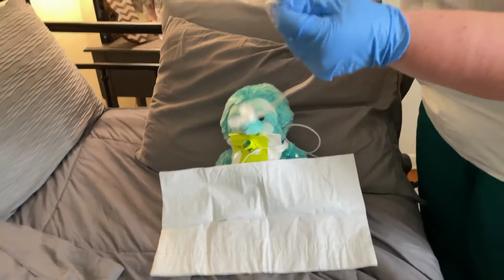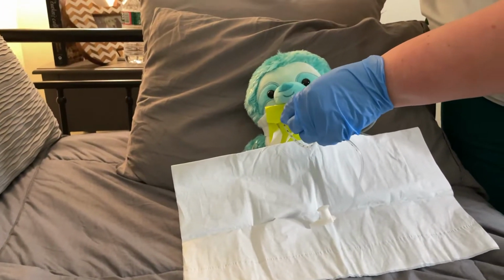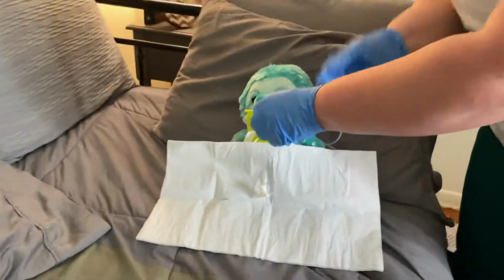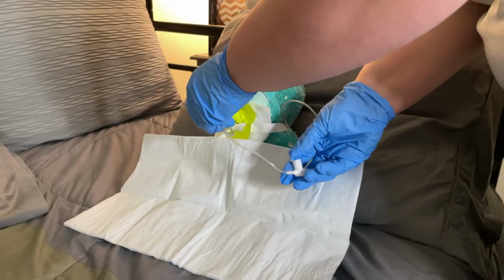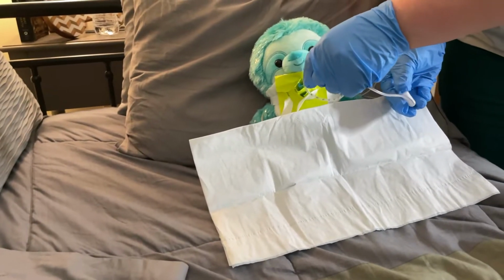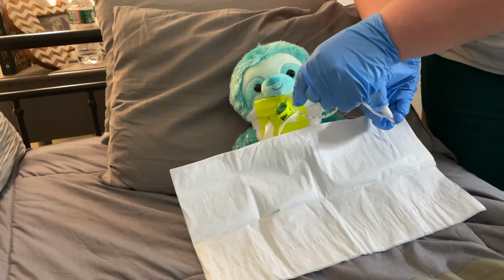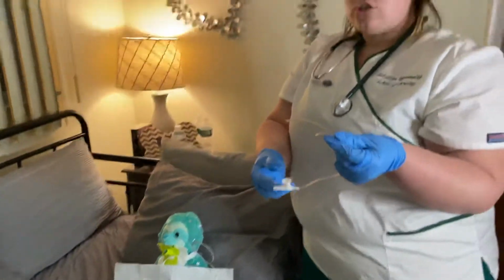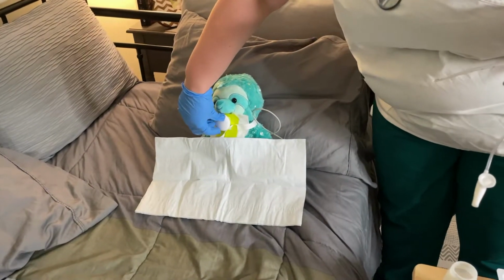And I'm going to take the tip of it and it's going to go into the inner cannula. You want to insert it about 12 to 13 centimeters. Then you're going to take your clean hand and, only touching the white portion, withdraw the suction tubing for 10 to 15 seconds, performing a swirling motion, and intermittently hit the suction. When you're going in, make sure you do not hit the suction going down. You only suction when coming out. Once that's done, you're going to replace the oxygen onto the patient to oxygenate the patient.